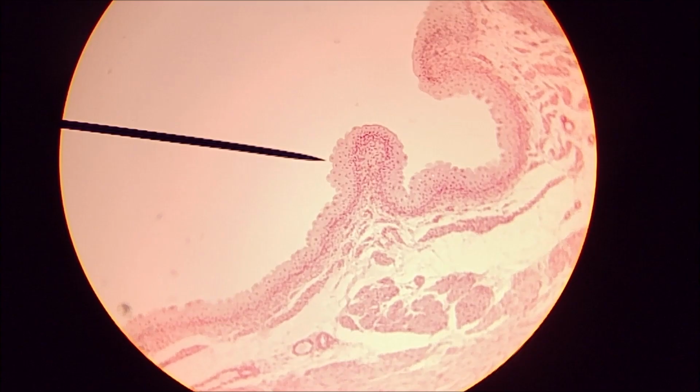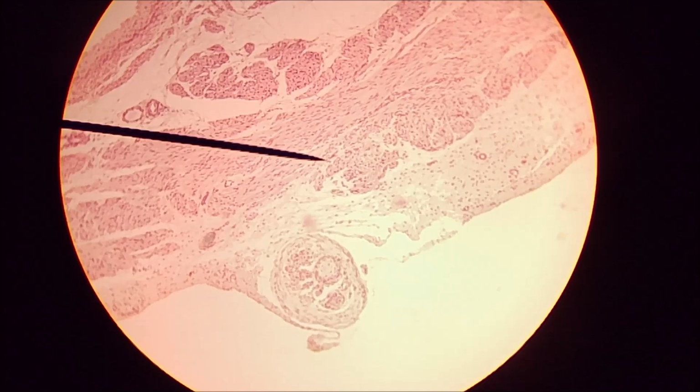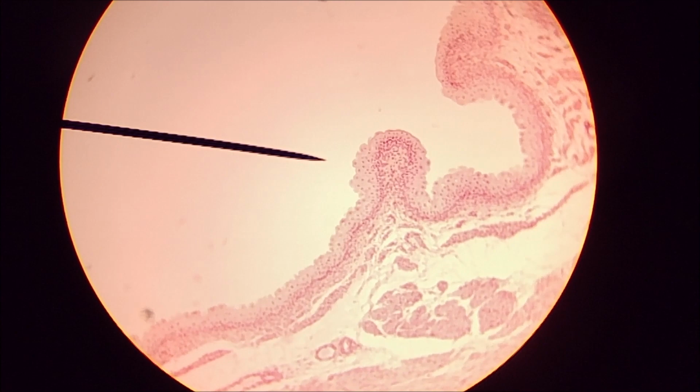What we have here is a bladder slide. This should look pretty familiar to you. You can see this border where I'm pointing. If I pan around a little bit, I can show you. Around here is smooth muscle all down in here, and then the epithelial lining is this bit here. Now I can zoom in a little.